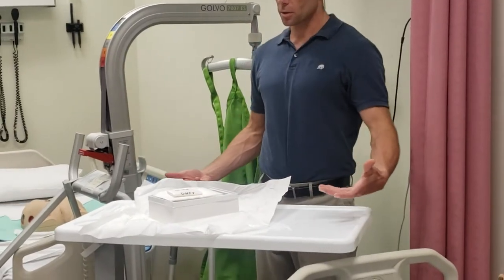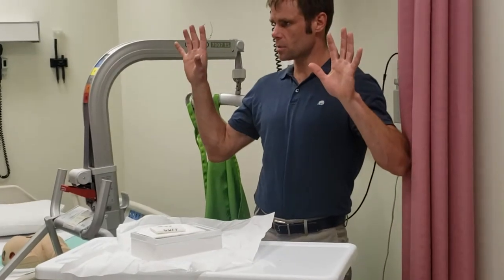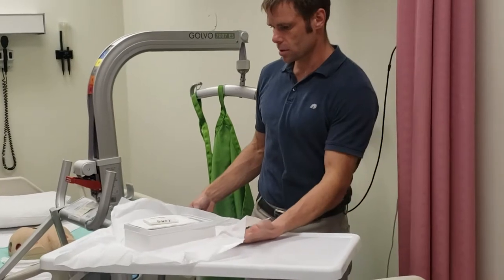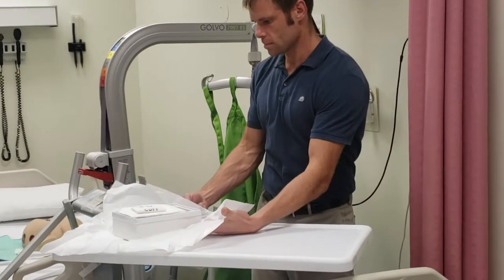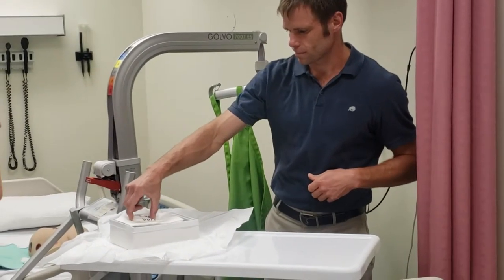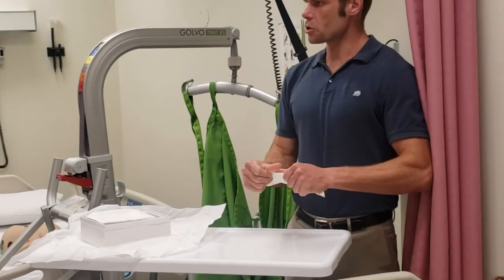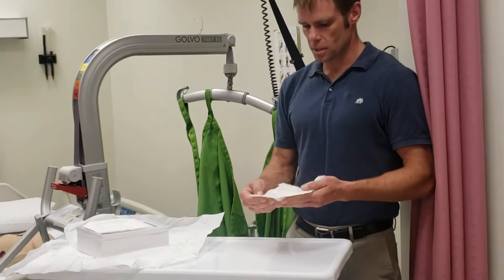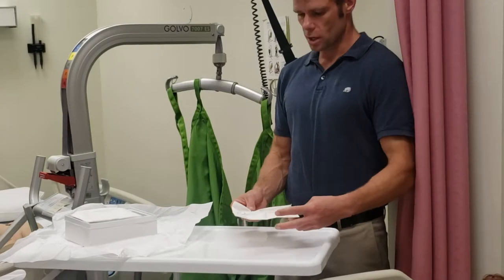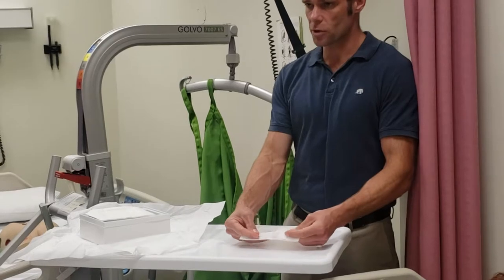When I square it up I have to go underneath. Now everything is sterile but my hands are not sterile. So how do I become sterile? I grab the sterile gloves without touching anything else. Now if you have larger hands, in real life I always bring another pair of gloves in, because I can probably get my hands in without ripping them — but there's a 50-50 chance. If I'm doing this with a real patient I don't want to risk ripping my gloves, so I bring another pair. You guys can do that for your checkouts also.